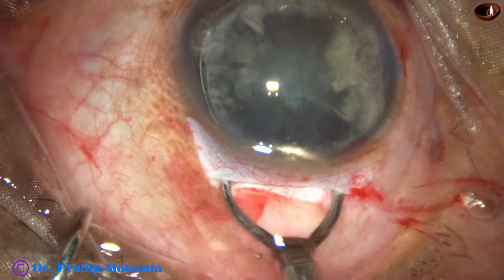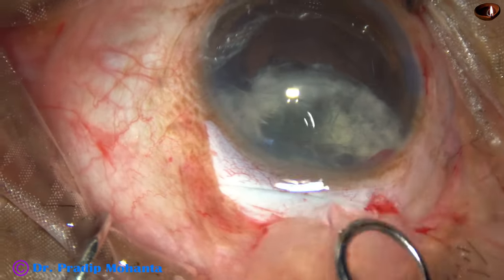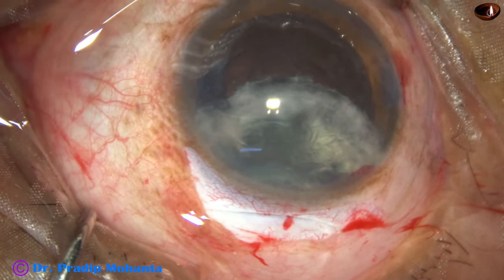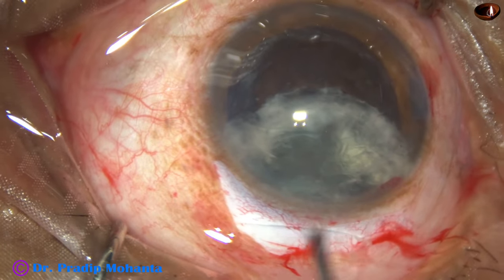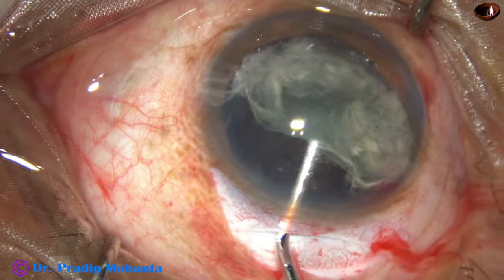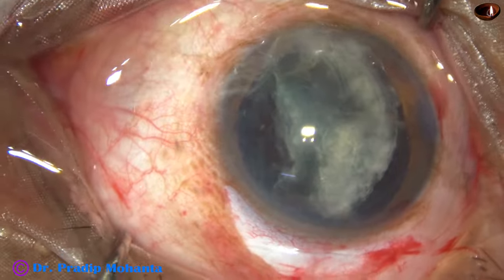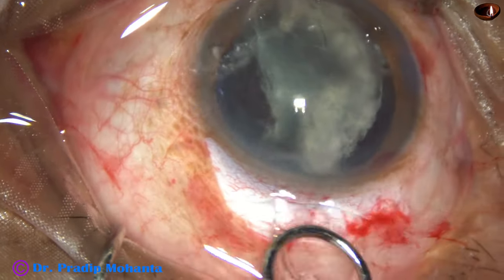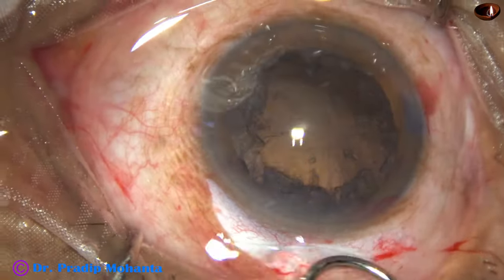Visco is always used to protect the corneal endothelium. Now, using the irrigating vectis — see what has happened: the nucleus has broken at the incision. So what to do now? Inject visco, and place the other half in the correct orientation. Orient it in this way and again go with the irrigating vectis. And this time it comes out easily.